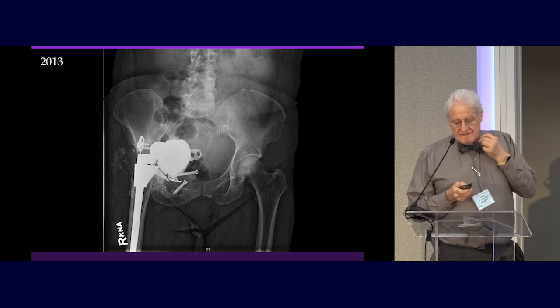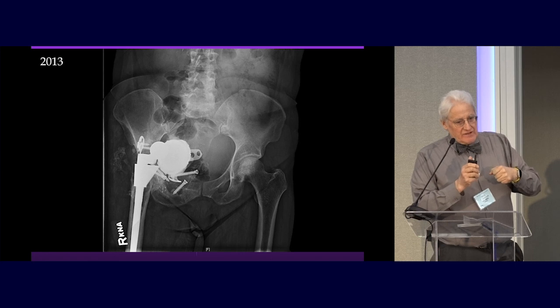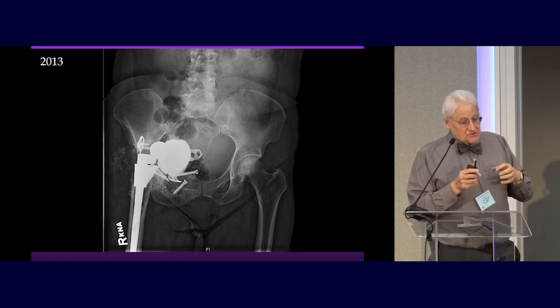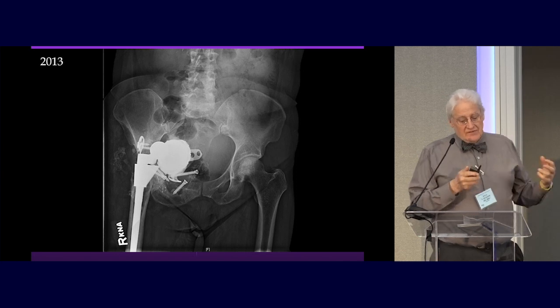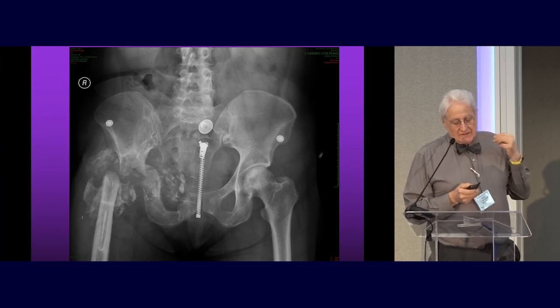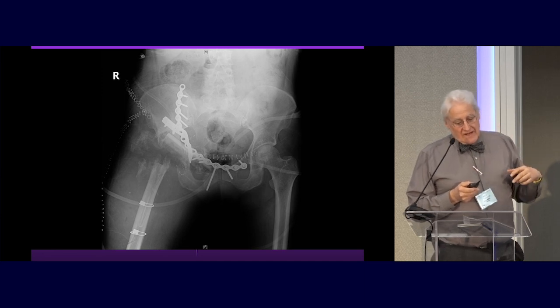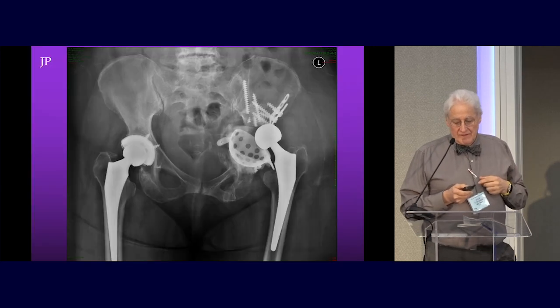Another one: what happens sometimes is the poly wears out, you get metal-on-metal lysis, and the whole thing gets into the pelvis. That's why I follow the hips at least every 2 years, because if I see some eccentric wear, I can go in and just switch the poly. If you wait too long, then this is a much harder case to do. Again, it was infected. We had to wait a little bit. Really nothing there. We ended up putting the allograft in first, let that get stronger, fixated it with this plate, and then eventually we were able to do the hip replacement.